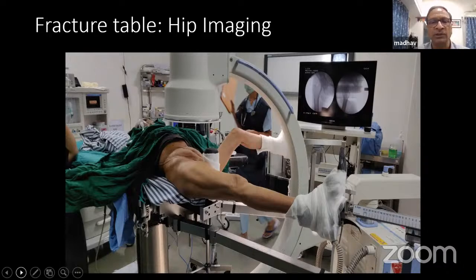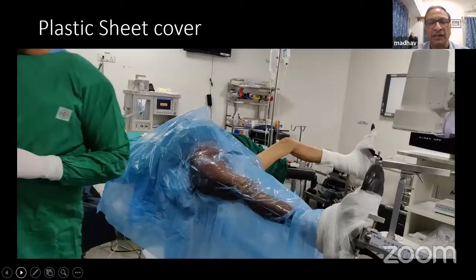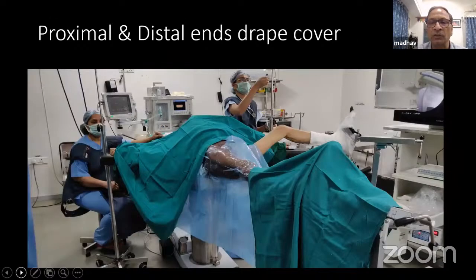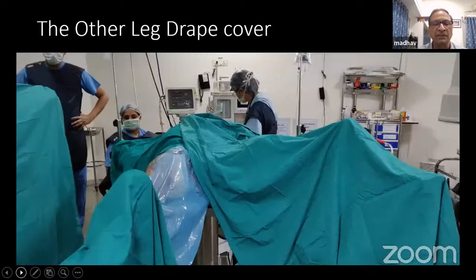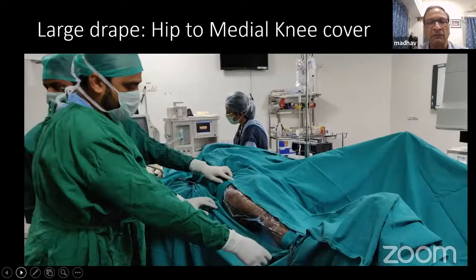So here is the view of the operation theater where an anesthetized patient with an intertrochanteric fracture is fixed on a fracture table. That was a lateral view; this one is the view from in between the two lower limbs. As you can see, the leg to be operated is the right one, which is straight. The other leg is flexed, abducted, and externally rotated at the hip, so as to allow good space for the C-arm to go in for the AP and lateral views, because for a lateral view, the C-arm tube has to go below the hip and come up on the other side. So these are slides of how you drape. We will come to the video shortly.